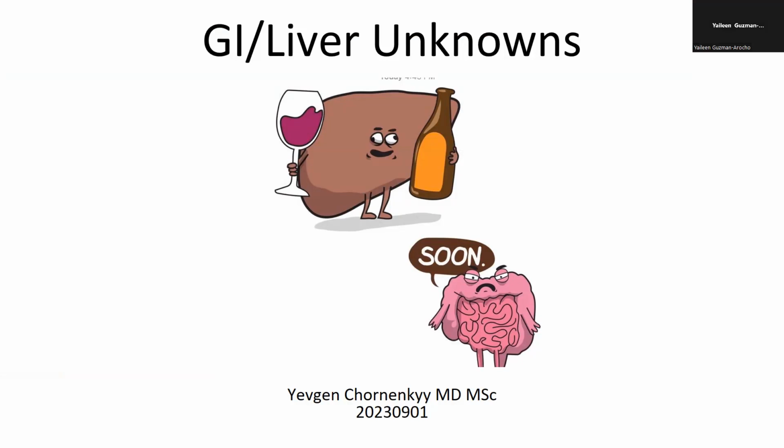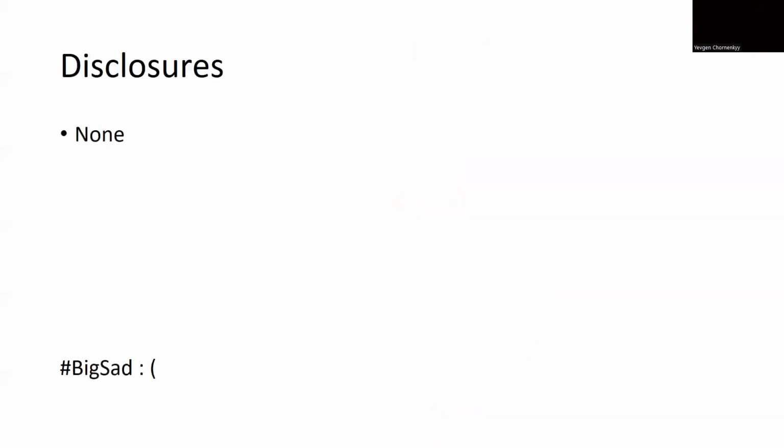So for this session, I thought we can focus on some GI liver unknowns. These cases are the cases I've encountered during residency, and we got a slide scanner, so I was able to scan some slides, and that's where they come from. I don't have any disclosures. I'm very sad. I'd like to have some disclosures one day.